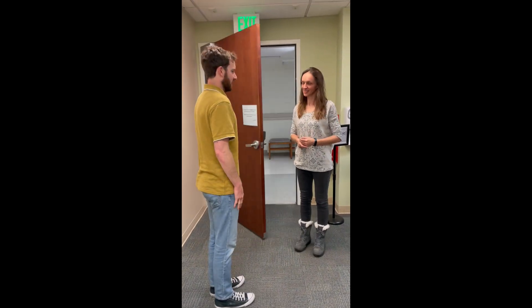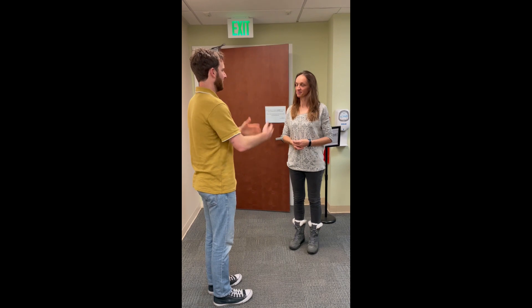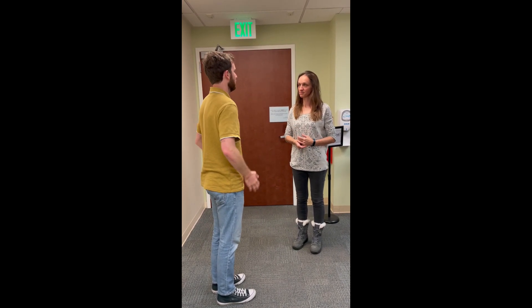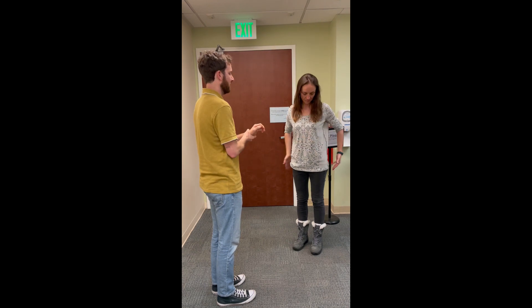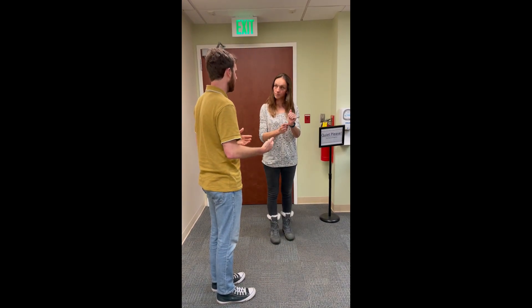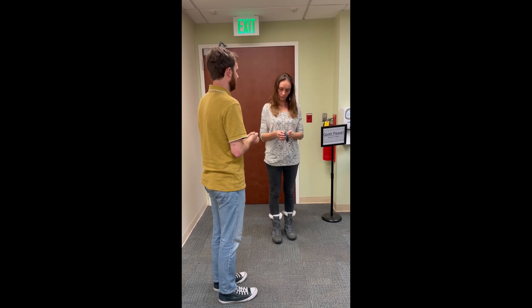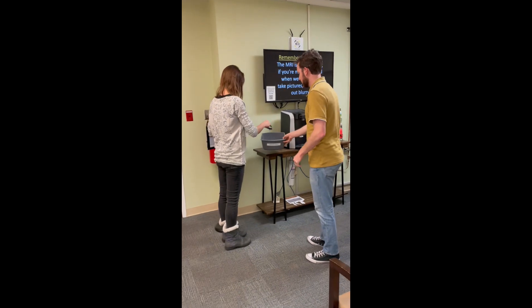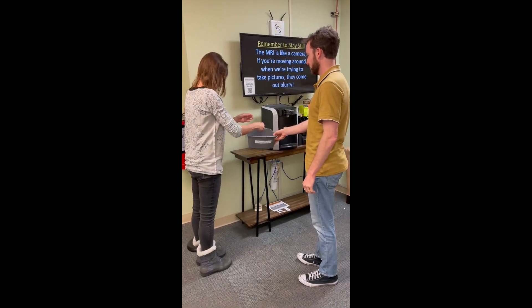Welcome to CCN. We're going to get started with your session by having you demetal in the lobby area here. We're going to ask that you remove things in your pockets, anything on your wrist, belts, watches, jewelry that you have on, so earrings and things like that. There's a bin where you can put your items if you'd like, or if you have a bag, you can place them in there as well.